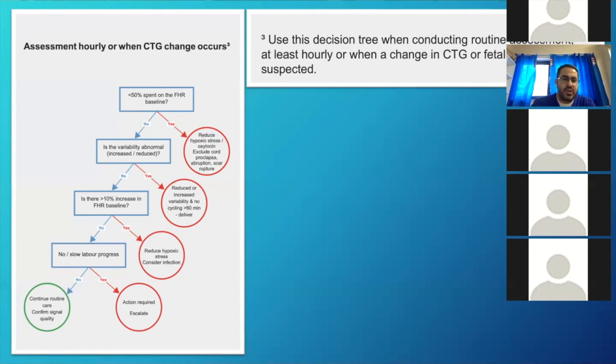So we try and make this baby happier. And obviously, when there is a rise in baseline, you also need to think about, is there any chance of infection? Or is this hypoxia? Why is the baseline going up? Any rise in baseline, you always need to think about it and justify why this is happening. Does that make sense? Okay. If along the way anything is triggering a review, then that's a reason to escalate and have further discussions.